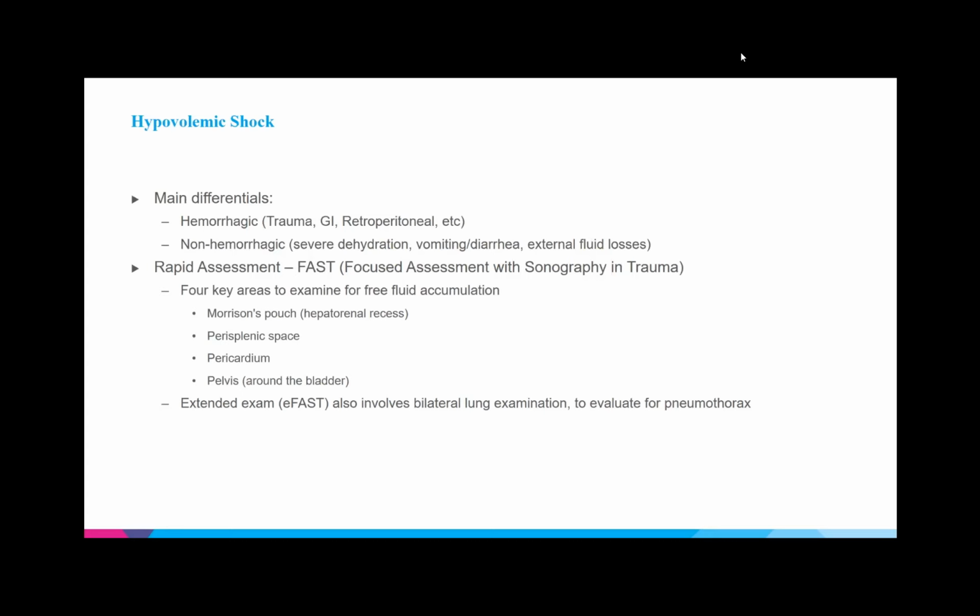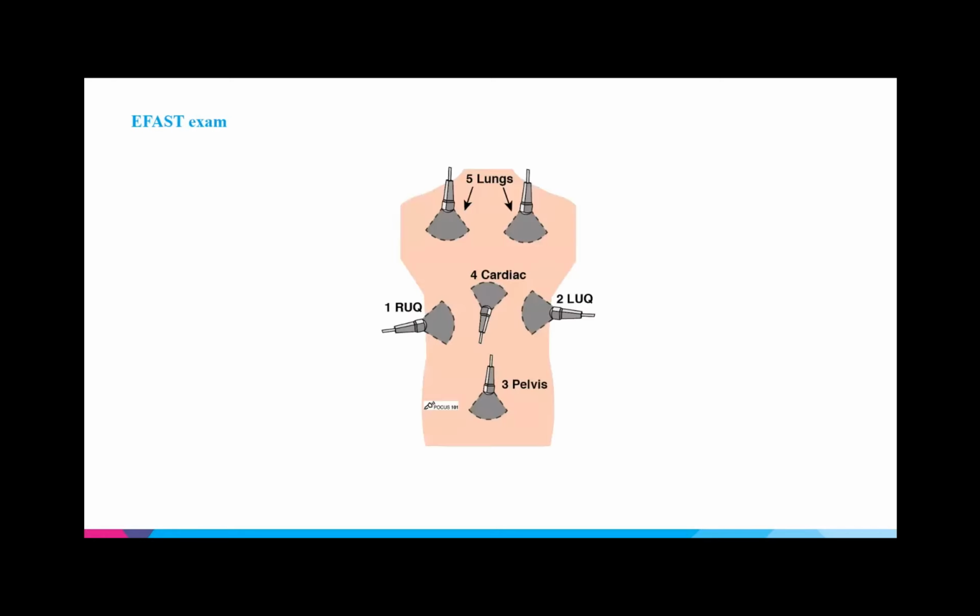And this is something that you could do very quickly. If you're worried about a patient who came in unresponsive, was found down outside, you're not sure if there was trauma sustained, it's something you can look at very quickly to decide on your next move.